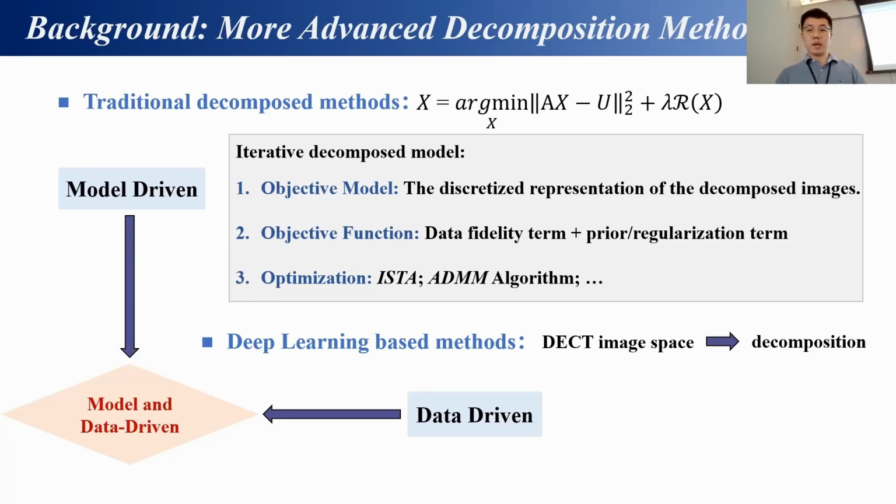The deep learning method has passed the US FDA certification recently. It makes full use of the powerful performance of the convolutional neural network and uses a large number of paired training data to describe texture features and learn the complex nonlinear mapping relationship in this decomposition process.